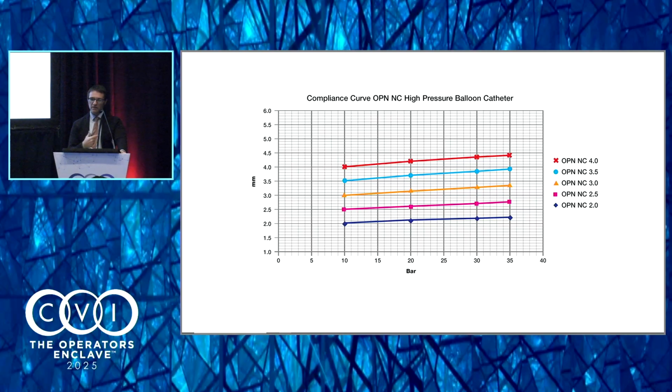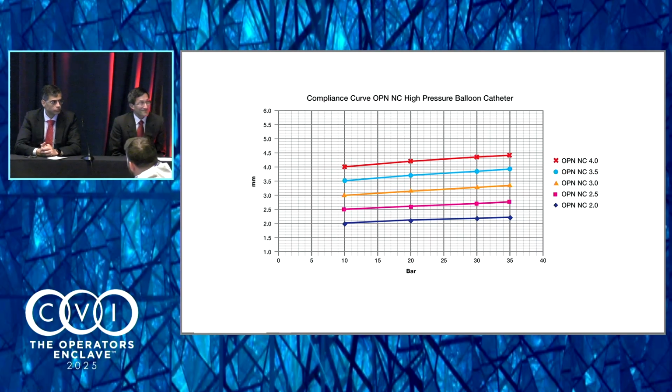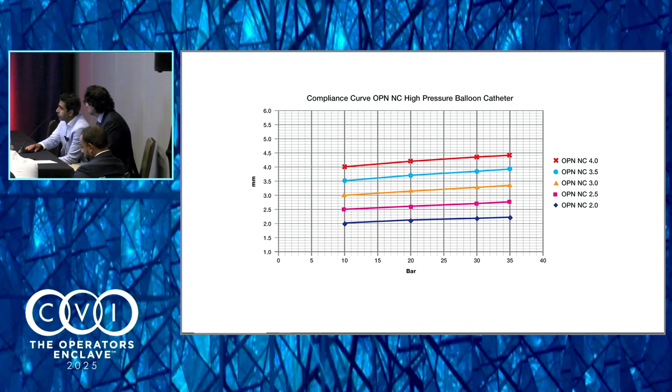The only thing we get is perforation, if some nodules perforate the arteries sometimes, but in clinical experience for me it is a rarity. I don't know what your experience is with nodular perforation. Yeah, you see them occasionally, particularly in eccentric nodular calcium, and particularly with oversized balloons. And sometimes you get too carried away going 1-to-1 with a D-shaped stent, and that's where you can run into problems, where your area is quite good and you should probably walk away, and you just want a perfect round stent.